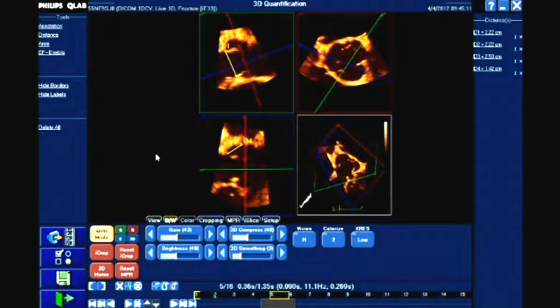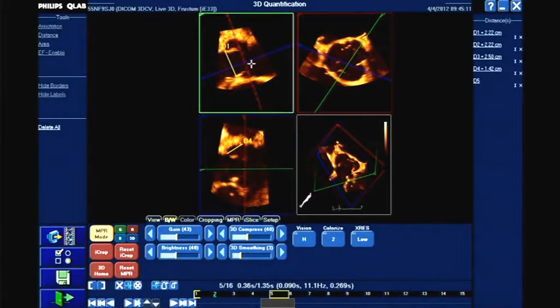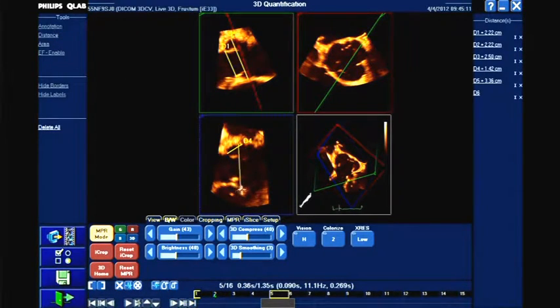So it's always easier, of course, in a normal aortic valve without extensive valve and root calcification. But again, this illustrates the principles of the three key measurements that we need to make. The measurements of the sinuses, which I can just show you here. So we can again do this in multiple planes. So here we have sinuses of about 37 millimeters in this plane, and we can measure them across here as well. And there they're 34 millimeters, and of course we could do that going all the way around, all three sinuses.